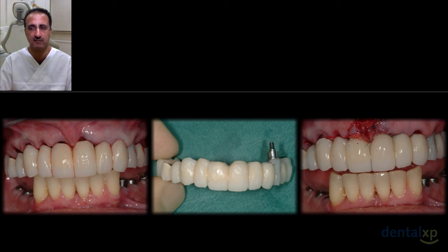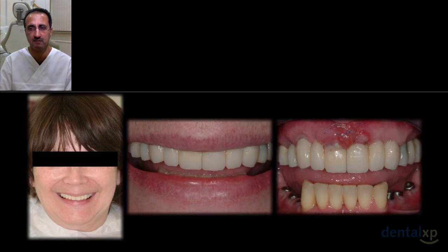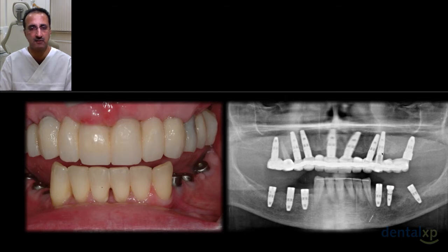And you can see we've carried out some soft tissue work, frenectomy, along with some connective tissue grafting. It looks a little bit messy at this stage. Provisional bridge is in. We're allowing things to heal. This is kind of how it looks. So this implant here is retaining the bridge, the tooth is retaining the bridge, and it's also sitting on the healing abutments, so it's supported under loading across the whole arch. And this works pretty effectively actually in these cases, and simple to do rather than trying to connect all these implants to the bridge in one session.